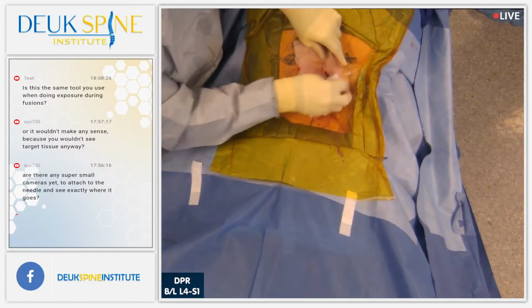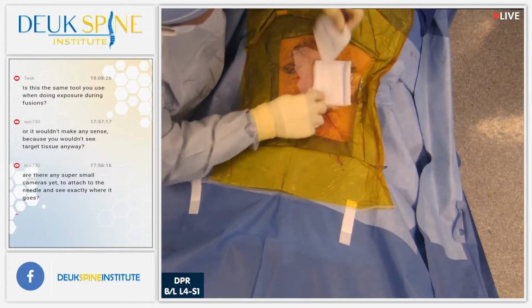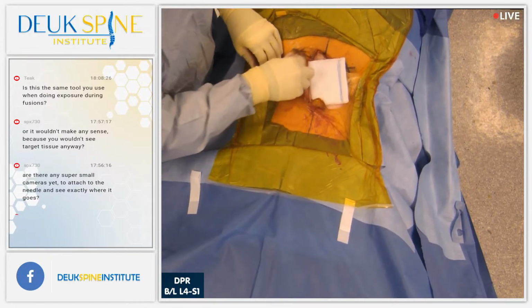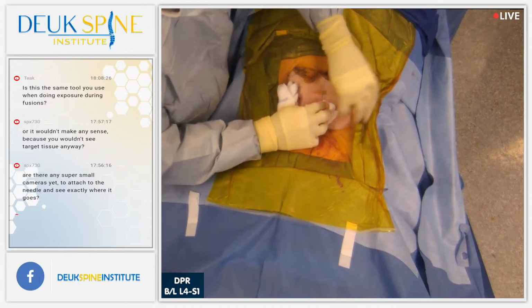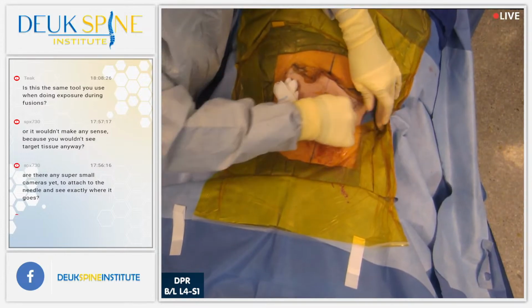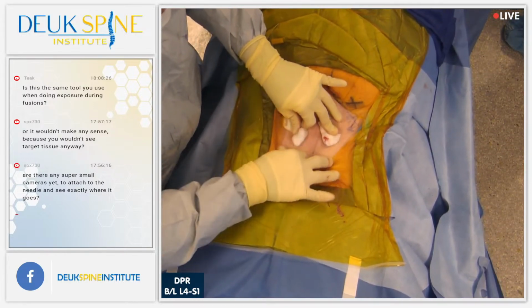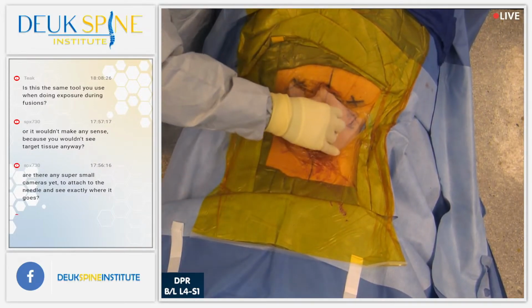And the question comes from Teak on YouTube. Hi there, Teak. And they ask, is this the same tool you use when doing exposure during fusions? Yes, it is. Great observation, Teak. It is an extended guarded bovie tip. And that is it for questions.